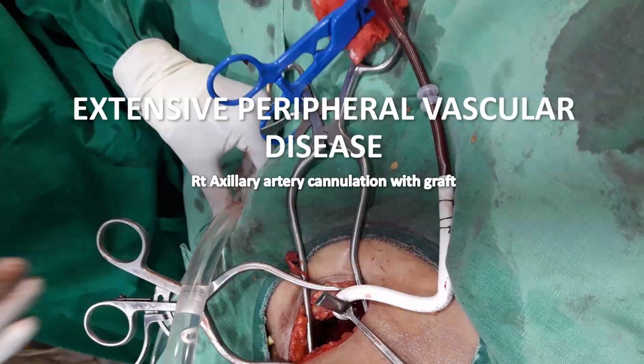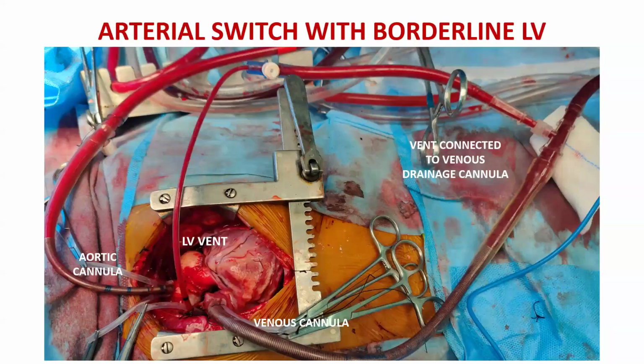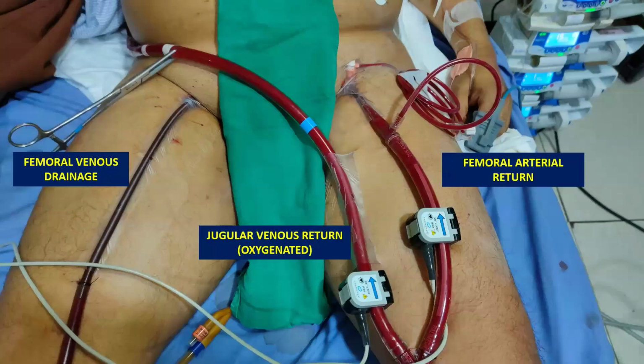Sometimes we need triple cannulation. Read about the Harlequin syndrome or differential hypoxia, where the heart is pumping out deoxygenated blood because the lung has not improved, and that is causing upper body hypoxia. What will you do? It can be solved by bifurcating the return into the arterial and another venous.